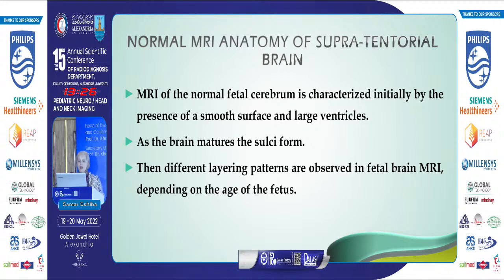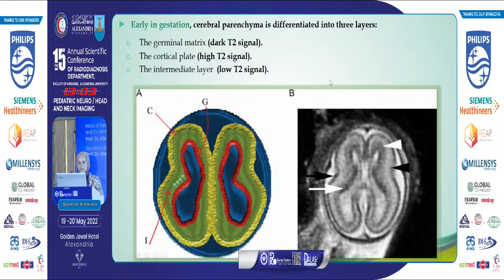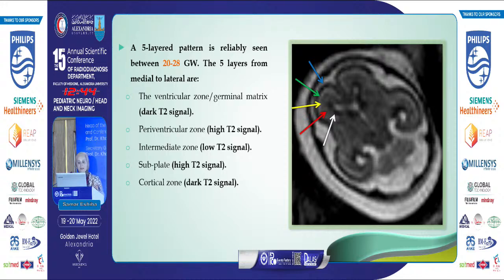The normal MRI anatomy of the supratentorial brain is initially characterized by a smooth surface and large ventricles. As the brain matures, sulci form. In early gestation, cerebral parenchyma differentiates into three layers: the germinal matrix layer appearing as dark T2 signal, the cortical plate layer appearing as high T2 signal, and the intermediate layer appearing as low T2 signal. This is followed by a five-layer pattern seen between 20 to 28 gestational weeks, from medial to lateral: ventricular and germinal matrix zone (dark T2), periventricular zone (high T2), intermediate zone (low T2), subplate (high T2), and cortical zone (dark T2).